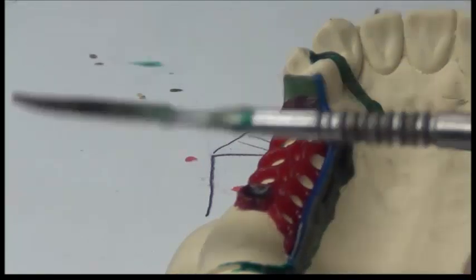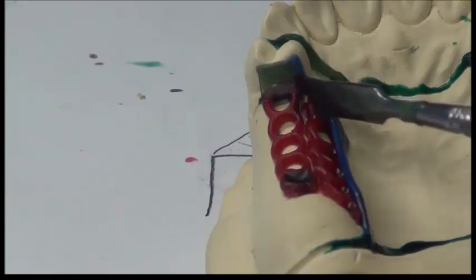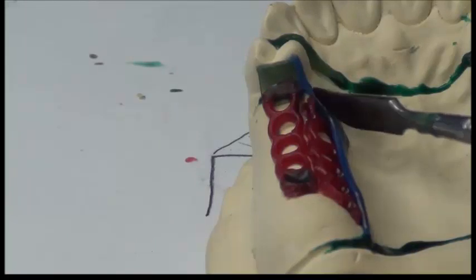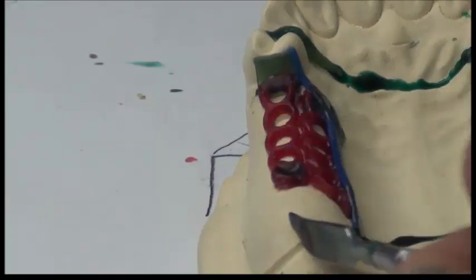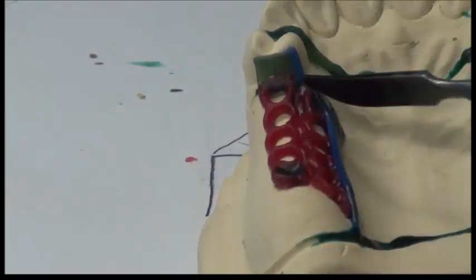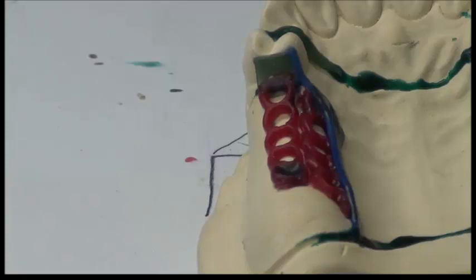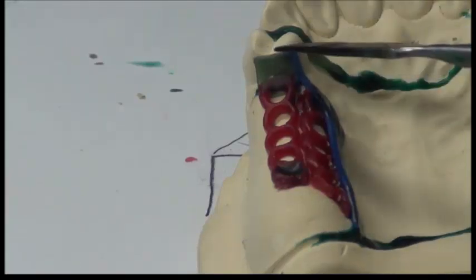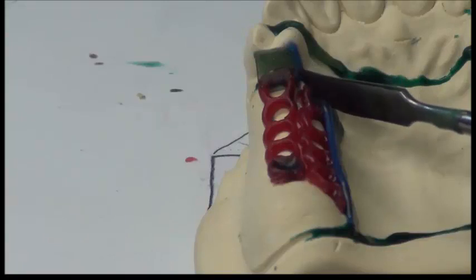outer side or the palatal side, but in the guide plate area, there should be a step. So if I am touching the guide plate to the external finish line, I feel a step here. Okay? There is a step also here. I feel a step also here. So the step is not only horizontally running with the ridge, it's also present vertically, running on the palatal or lingual surface of the guide plate. Okay? So the external finish line ends on the palatal surface or the palatal side of the guide plate up to the last occlusal part of the guide plate. So there is a step running from here up to here.